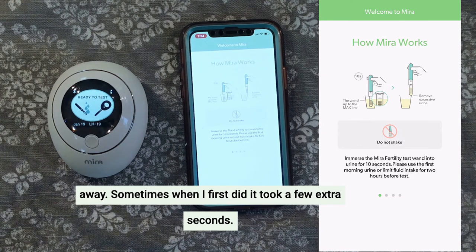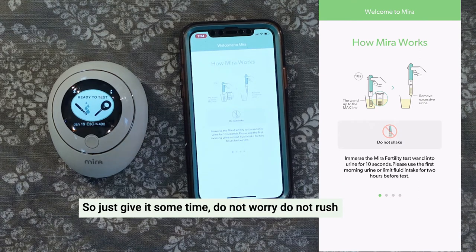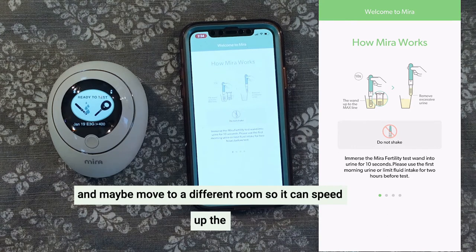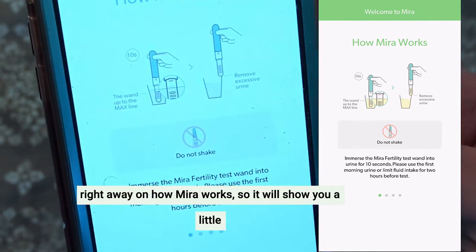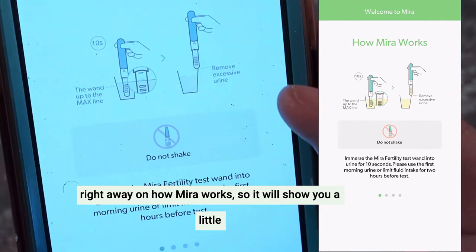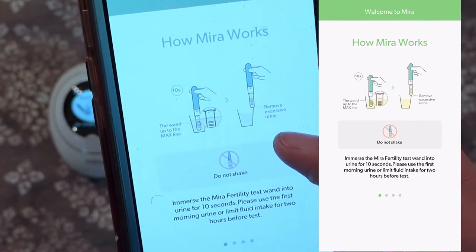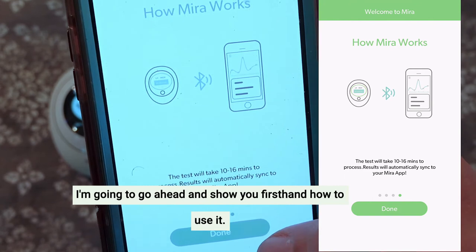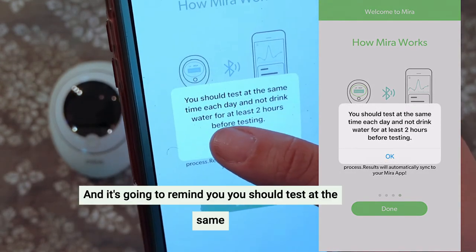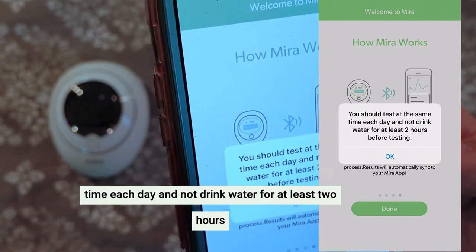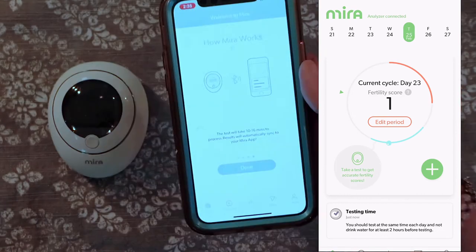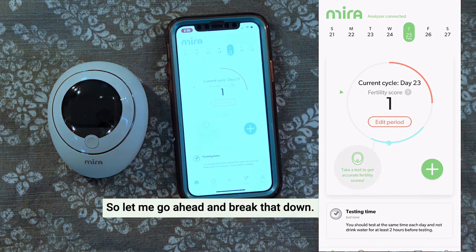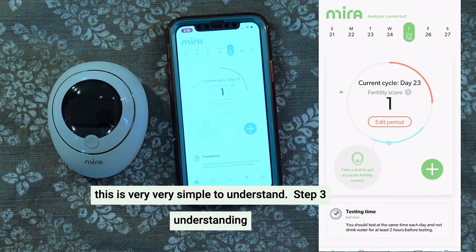Sometimes when I first did it, it took a few extra seconds, so just give it some time — do not worry, do not rush it. As mentioned, if it takes a little longer than usual, check how many Bluetooth devices are around and maybe move to a different room to speed up the process. After it's connected, it's going to guide you right away on how Mira works. It will show you a little display. But don't worry, I'm going to show you firsthand how to use it. Go ahead and hit Done. And it's going to remind you: you should test at the same time each day and not drink water for at least two hours before testing.